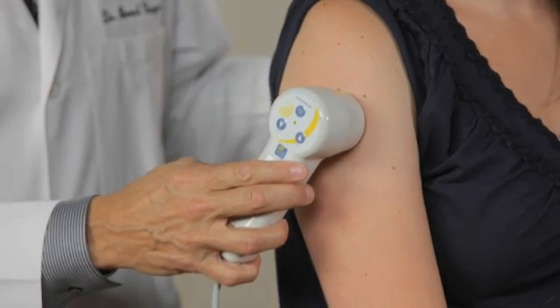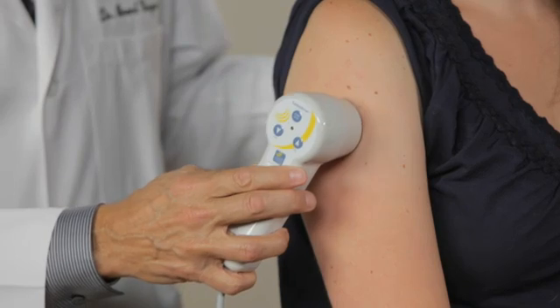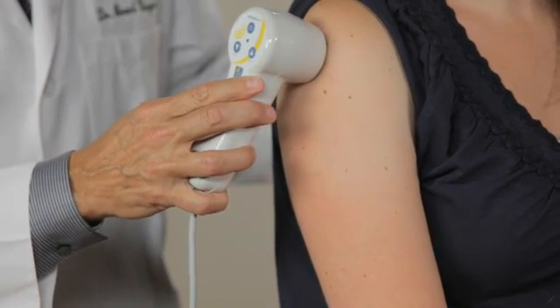As we scan, we are reading the local area, it's normalizing, finding the local impedance and then we will scan nice and easily as we move through.